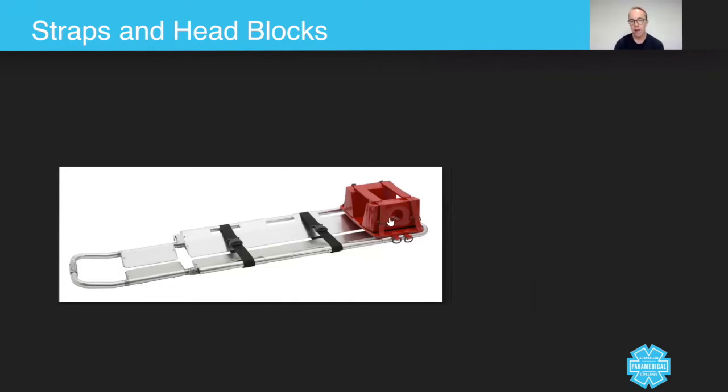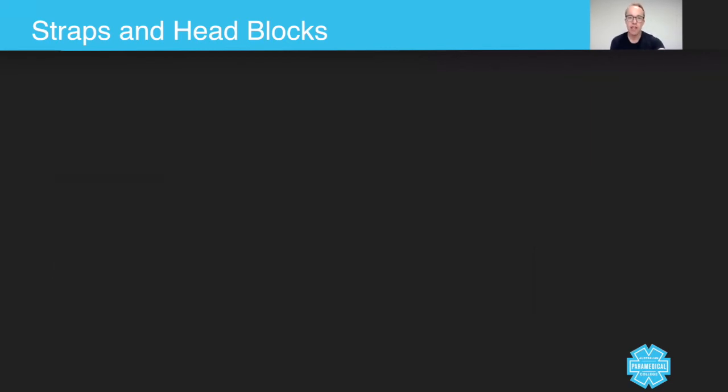Now typically you can see here a set of head blocks, which are used to keep the patient still. Now remembering that if you've assessed the patient as requiring some kind of immobilization, then you need to keep them still somehow. More and more often we're moving away from using head blocks and just using rolled up blankets at the side of the head, just because it's less intrusive. But regardless, you need to strap them down.